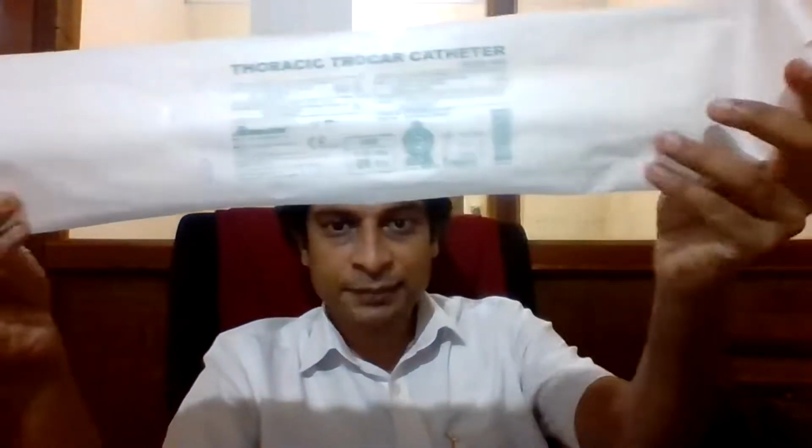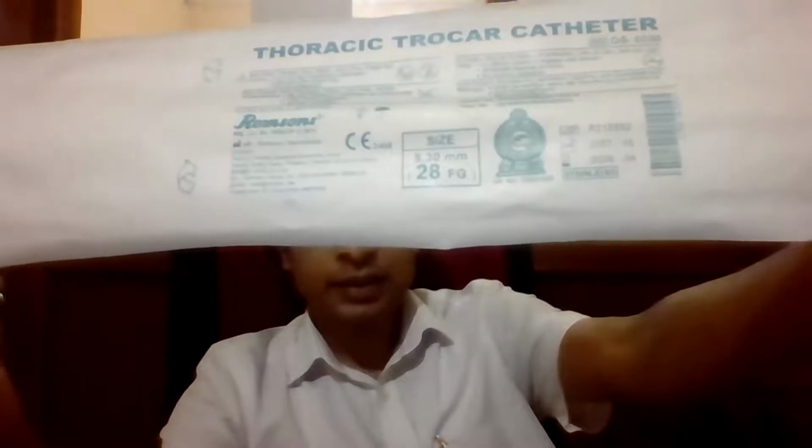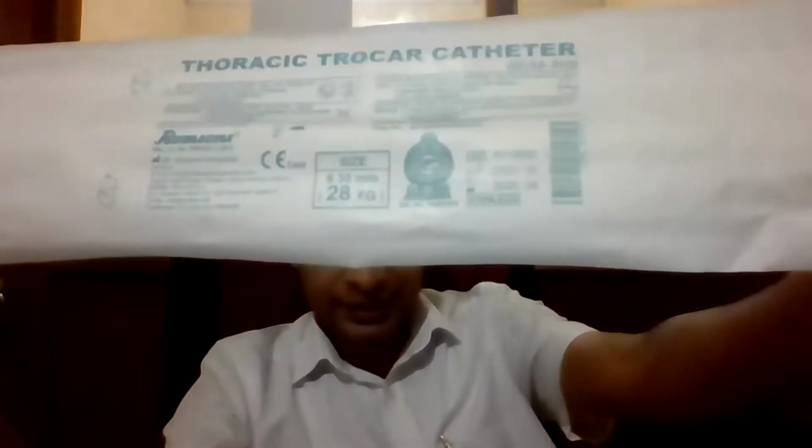French gauge, I'm afraid, is a bit confusing. French gauge is different from normal gauge. When the French gauge of a tube goes up, the tube size goes up. When the gauge of a tube goes up, the tube size goes down. So some tubes are sized according to French gauge, some other tubes are sized according to gauge. Needles are usually sized according to gauge, cannulas according to gauge.